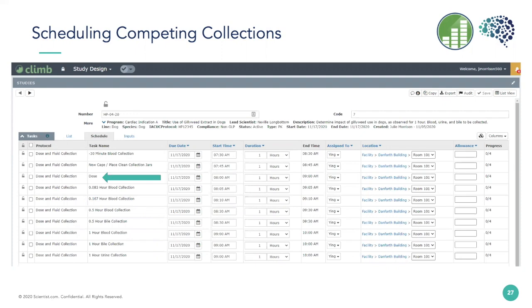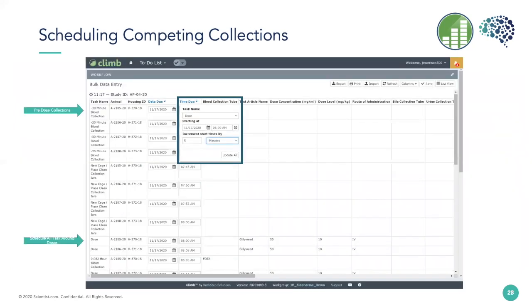Now, in this case, Meaghan knows that the caging area is in tight quarters. In this example, what we looked at before was having every dose at the same time, and you just work through those as quickly as you can. But here, because it's such tight quarters, we know it's next to impossible to collect the samples from the cages and shimmy past the other technicians and the collection lines in less than 5 minutes per animal.